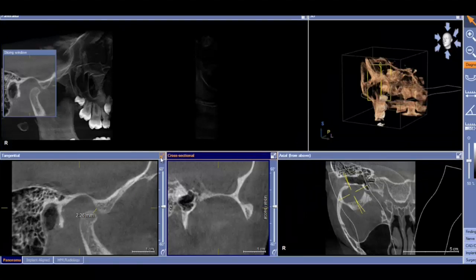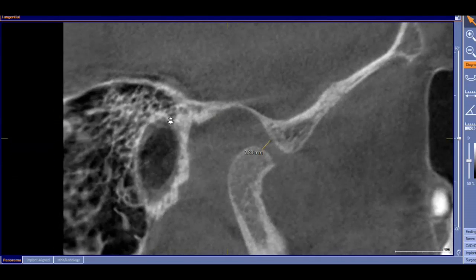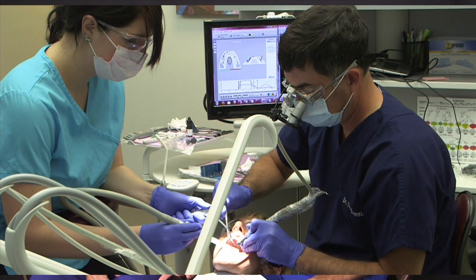And then oftentimes we'll image the joints with 3D imaging, and we'll use joint vibration analysis on most patients, because we want to rule out a capsular issue, and we want a stable and adapted joint, theoretically. But there have been times where I've worked on people, performed DTR on joints that are not stable and not adapted, and they improved. So that's a little sketchy there. It's pushing the envelope, but basically relax the lateral pterygoid, which is the muscle that pulls on cartilage, and things tend to not fall down that slippery slope, in my experience.